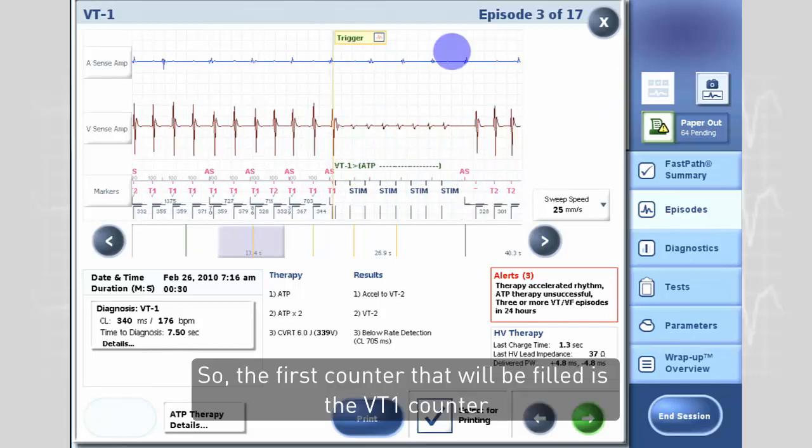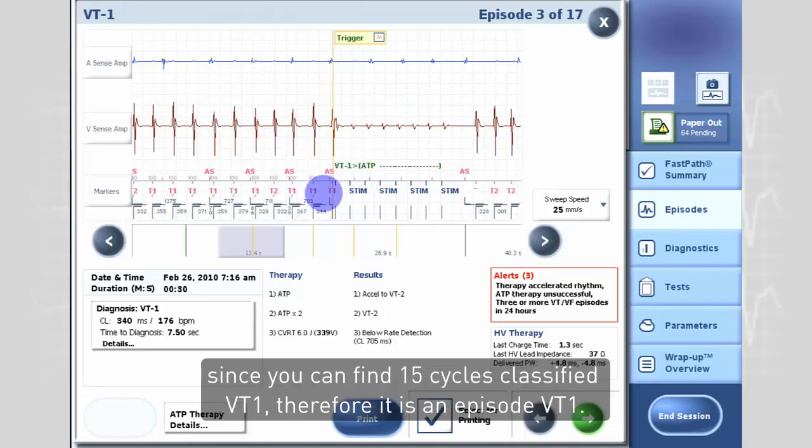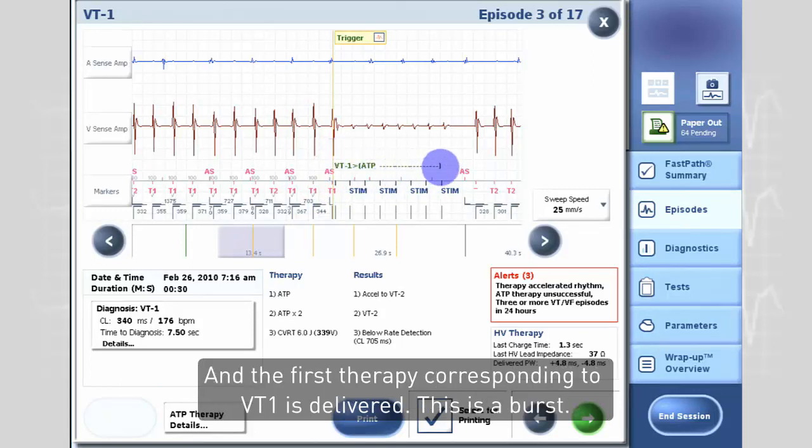The first counter that will be filled is the VT1 counter, since you can find 15 cycles classified VT1. Therefore it is an episode VT1, and the first therapy corresponding to VT1 is delivered. This is a burst.